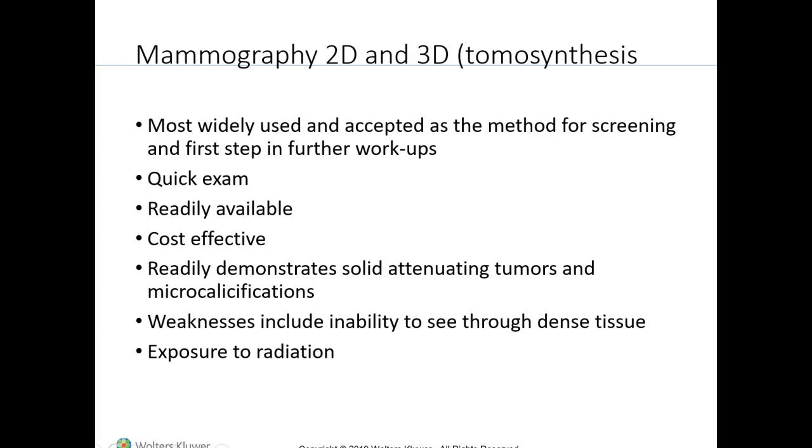The weaknesses of mammography is that there's a difficulty seeing through very dense breast tissue, thus the use of tomosynthesis so that you can look at very thin slices through that dense tissue, and also the exposure to radiation is a downfall of this technique.